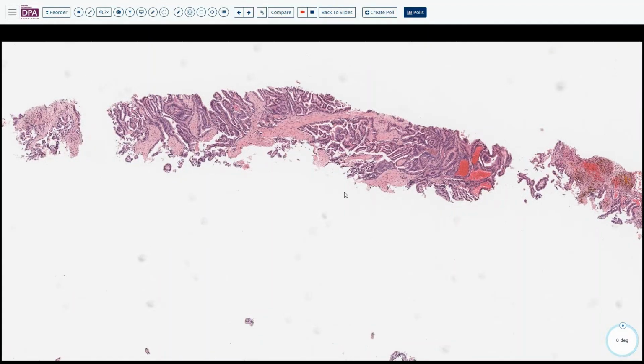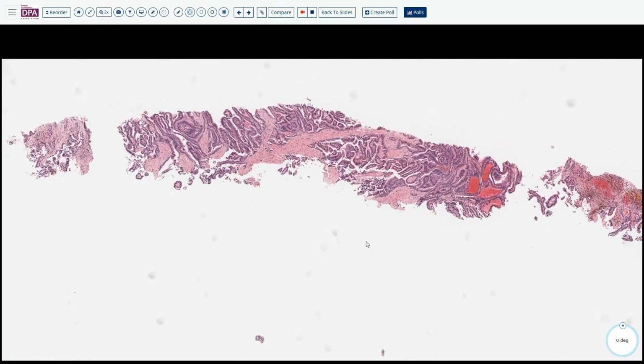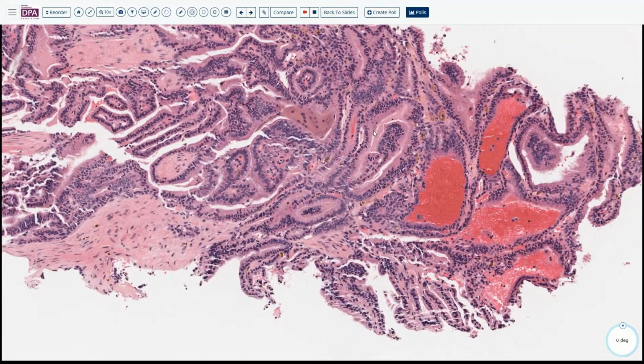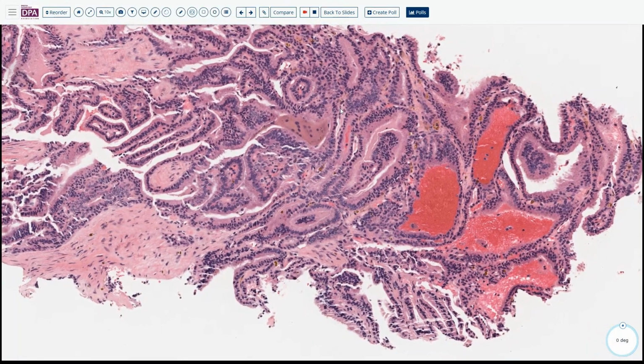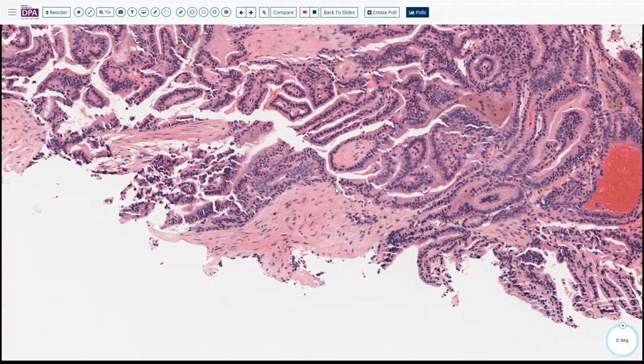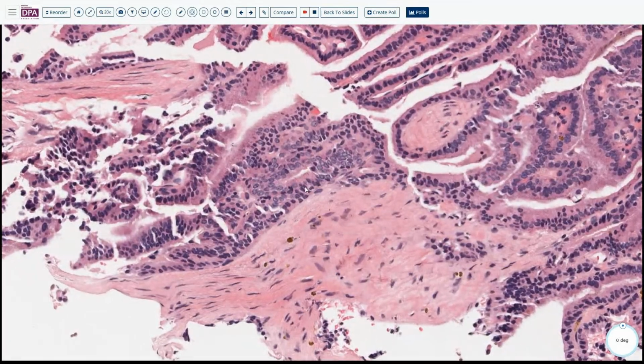I could try this one. This is another invasive papillary lesion. Not a whole lot of nuclear atypia with it. I might be hallucinating some chromatin clearing on it. It doesn't really look like breast carcinoma. Yeah, you can ask for staining. Should I get a TTF1 and a PAX8? Yeah, both are positive. Okay, then I'm thinking it might be like a papillary thyroid carcinoma.